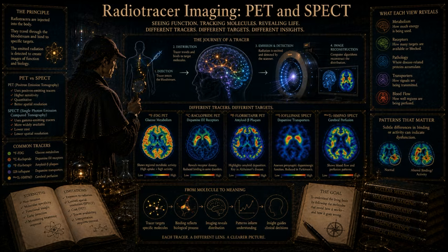But if you look at a raw sinogram, it just looks like a series of blurry, wavy lines. It doesn't look like a brain at all. How does the software rebuild a three-dimensional cortex from a massive pile of intersecting lines? This takes us into the realm of tomographic reconstruction. And historically, there has been a significant philosophical divide in how to do this: the analytical approach versus the statistical approach. The older foundational method is an analytical algorithm called filtered back projection, or FBP.